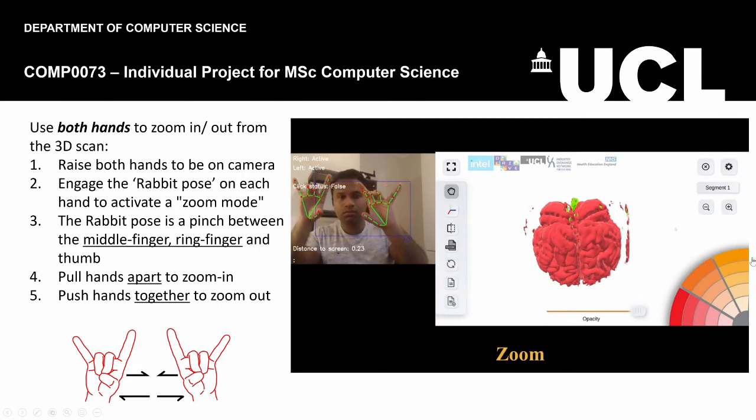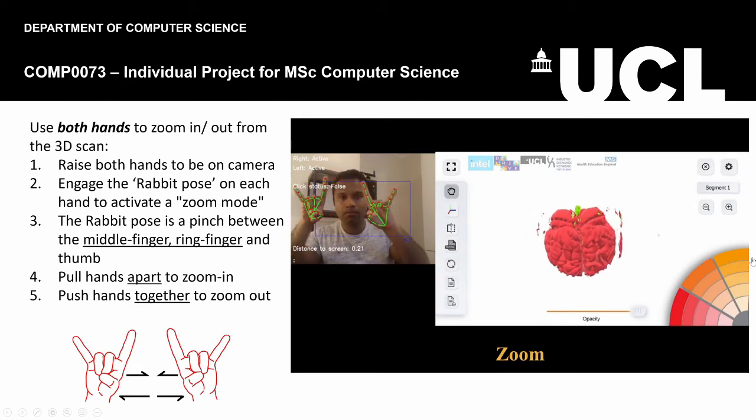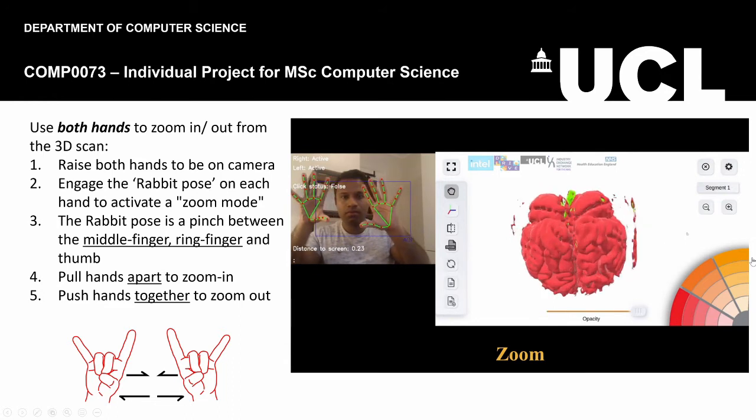So some of the bullet points in the previous slide get fulfilled by this functionality as well. Zooming is performed by engaging the rabbit pose on each hand and changing the distance between your hands, and this is inspired by how you zoom on mobile devices.